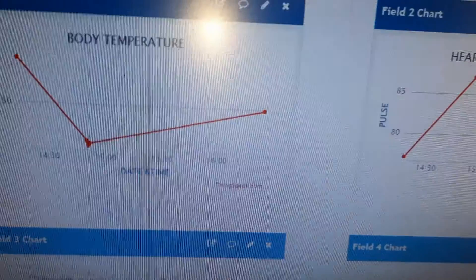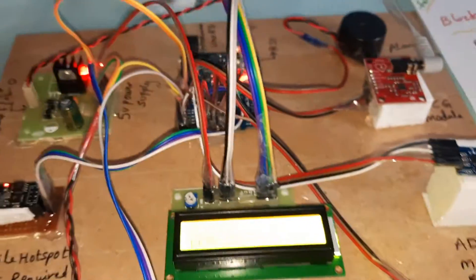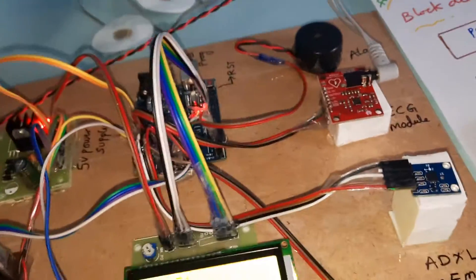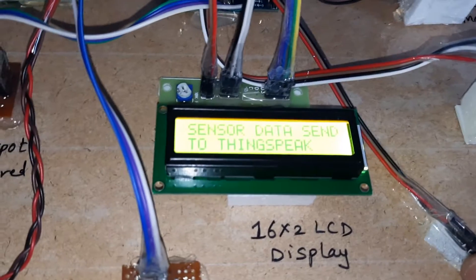Sending data. The time is 4:25 — sensor data is being sent to ThingSpeak. The data has been updated on the cloud. Now I will increase the humidity.